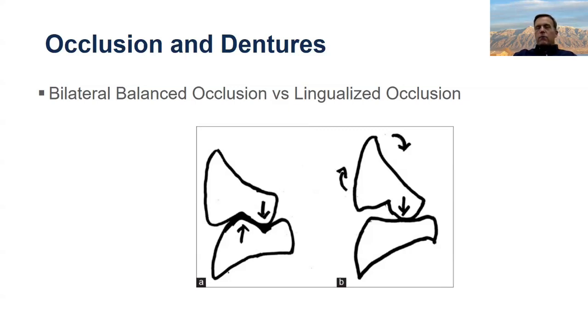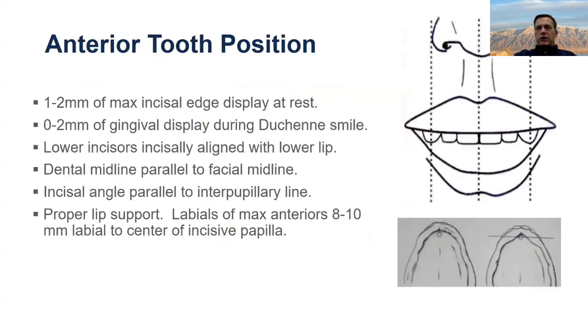So it's best in most situations for full dentures to keep your cusp angles 22 degrees or less. And most of the time when you're doing a lingualized occlusion, you do 22-degree teeth on the upper and then a 0 or a 10-degree on the lower. So definitely be thinking about this, and with all that you know about a particular patient, you can help your dental laboratory get a better result by letting them know what occlusal scheme will be best for a given patient.